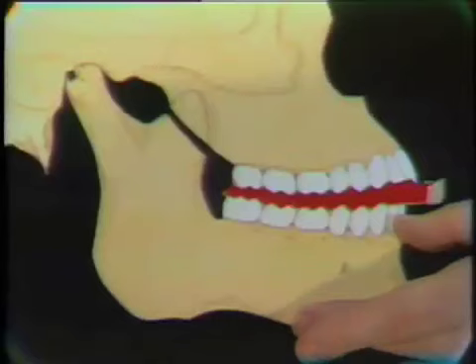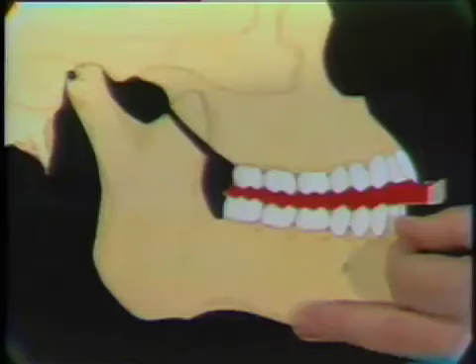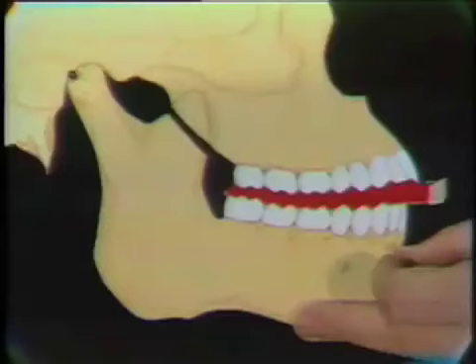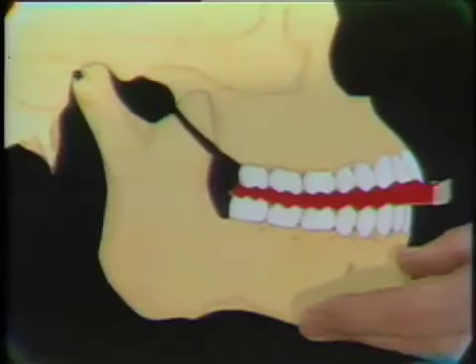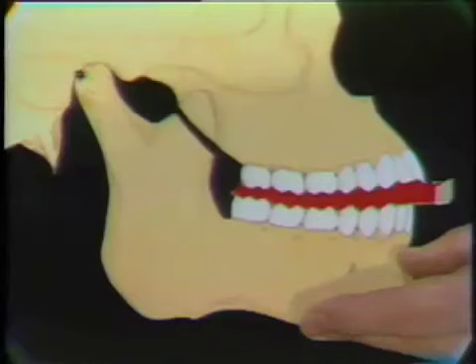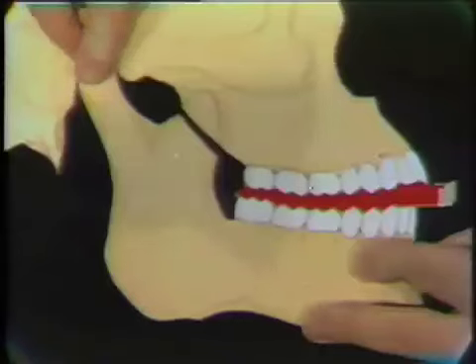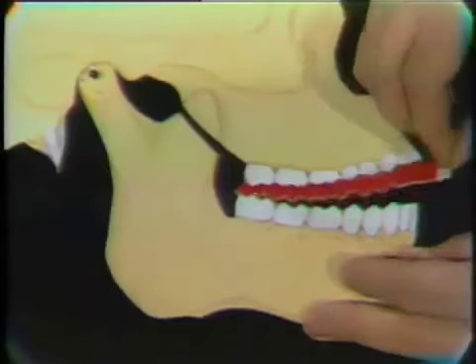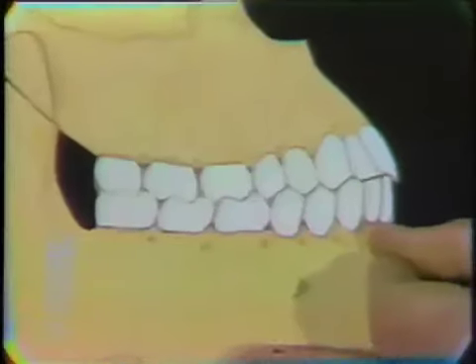So what we've tried to do is to show that the centric relation position is a stable position. Centric relation is a contact position along the hinge closure, or the terminal hinge movement. We take a bite with the teeth, a centric relation registration with the teeth apart, and expect to mount the casts on the articulator and take the centric registration from between the teeth, remove the centric registration, and have the teeth close into the same contact relation on the articulator as we had in the mouth.